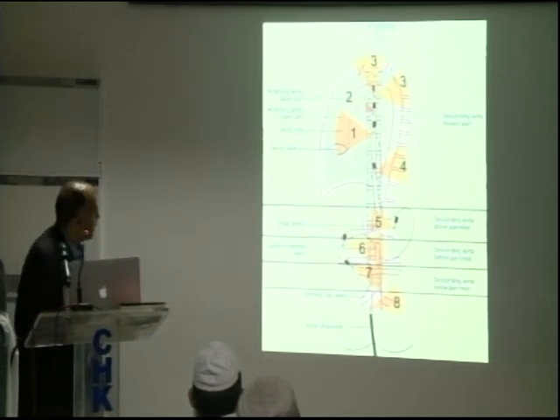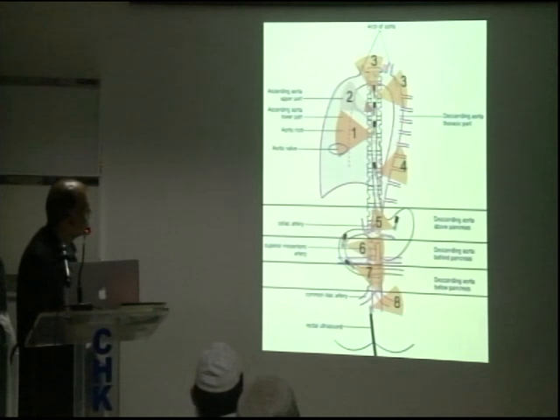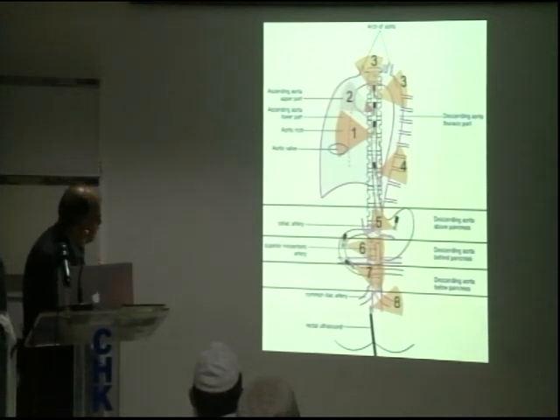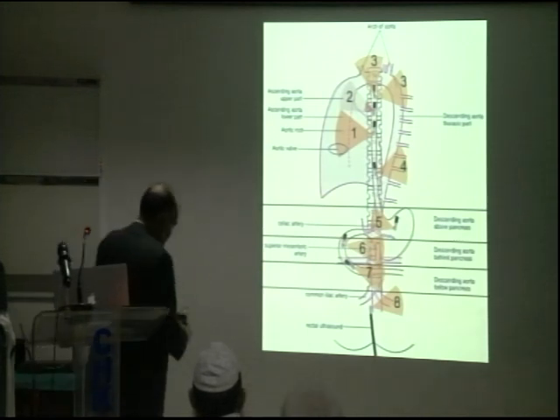And now, if you take the spine as a center reference point, you can see how it rotates. If it rotates like this towards this, so if you have a scope down like this, and the patient is lying horizontal, the scope is actually like this, right? So it's like this.